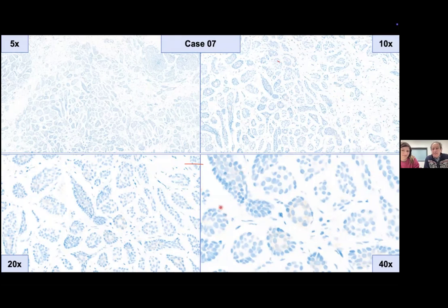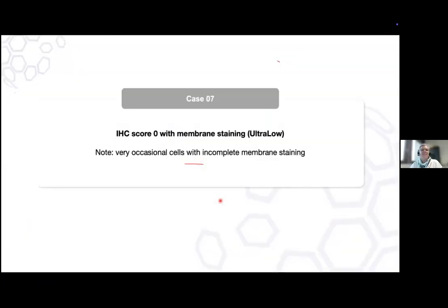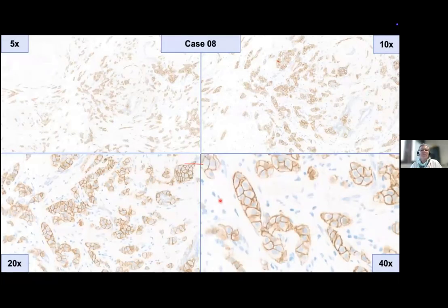Okay, Anne, but my session on dual-ISH is much shorter. Can I get one more case? I don't think so, because it's not the same people that will join the next session.